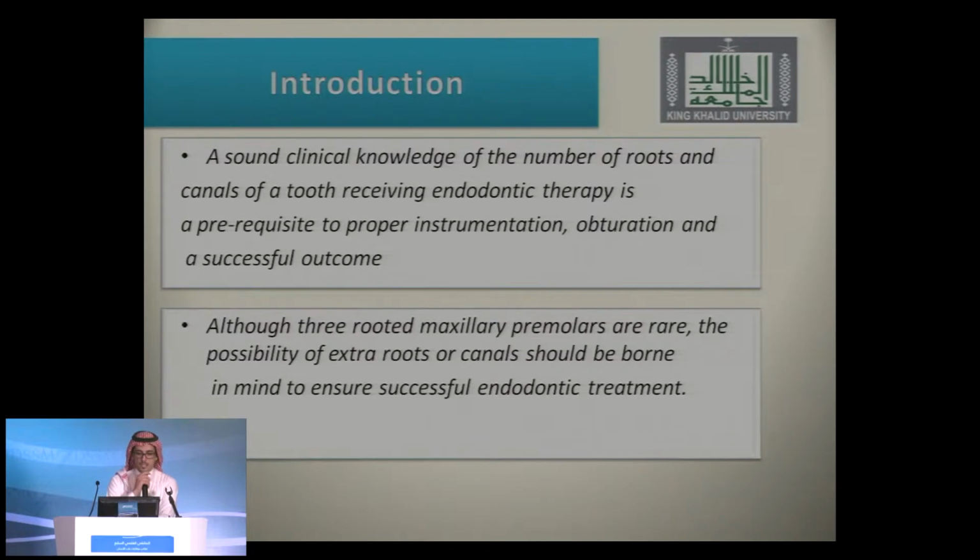Introduction. Clinical knowledge of the number of the roots and the canals of the tooth receiving endodontic therapy is a prerequisite to proper instrumentation and obturation and a successful outcome. Also, three-rooted maxillary premolars are rare. The possibility of an extra root or canals should be borne in mind to ensure successful endodontic treatment.